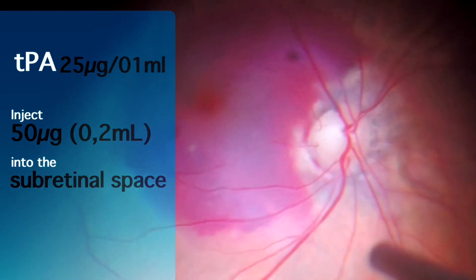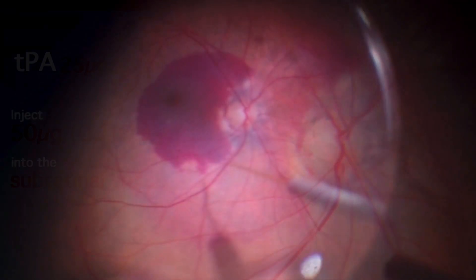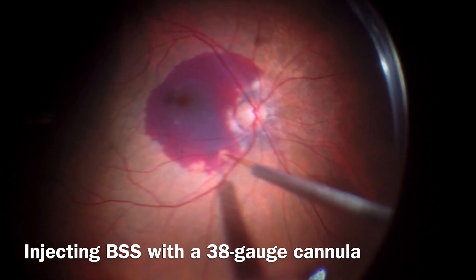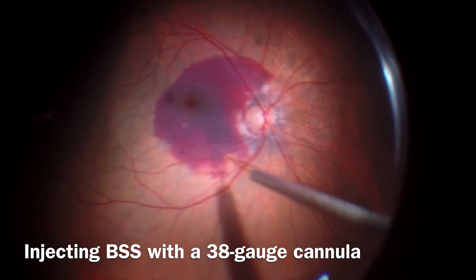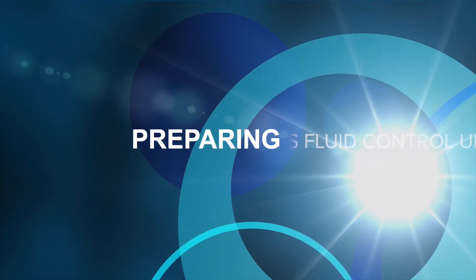You can either inject TPA directly into the subretinal space, or you can create first a macular retinal detachment to deliver the TPA through the same retinotomy. In this case, the surgeon performed first a BSS injection in the subretinal space using a 38-gauge cannula adapted in the viscofluid control unit.